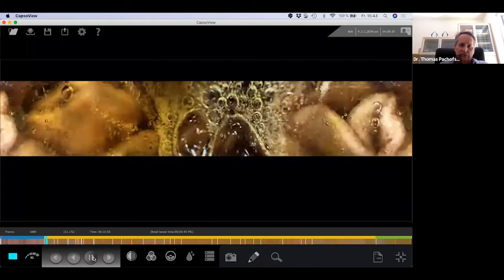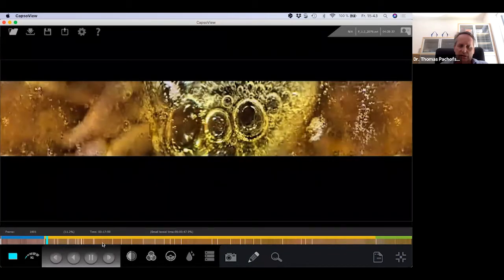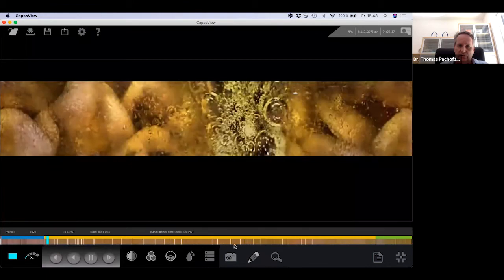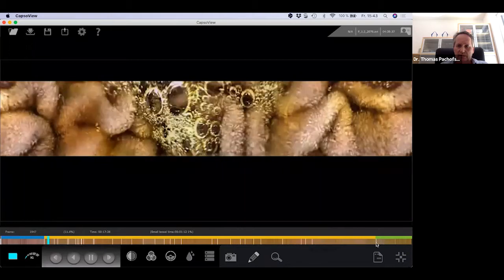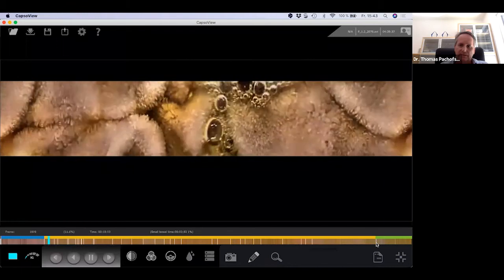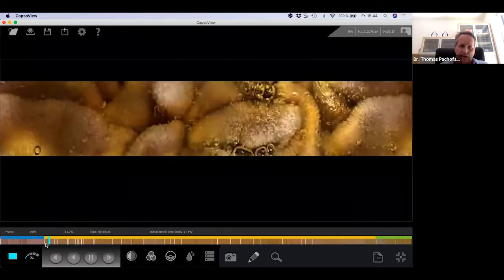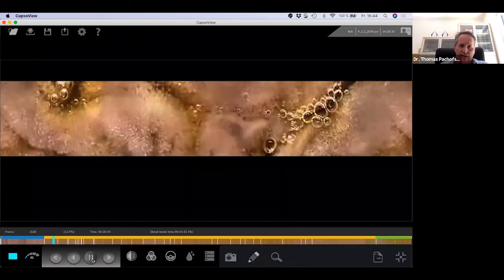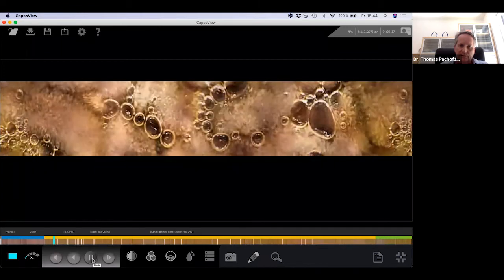And you can see, if you look here downstairs in the colorbar, we have some signs over the whole small bowel, and here also one in the cecum or in the colon. And if we're going here close to the first mark, I will show you now another kind of ulcer.